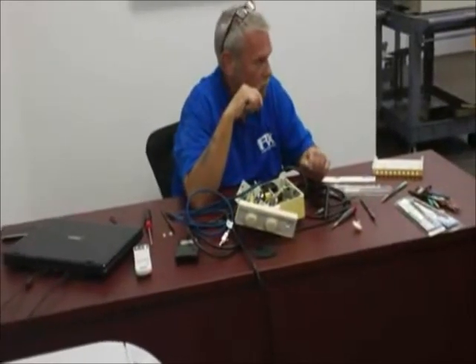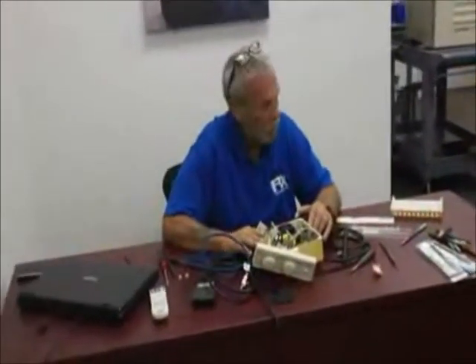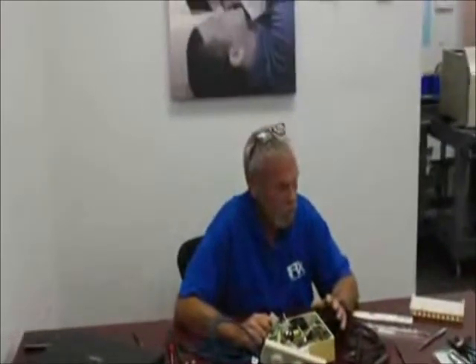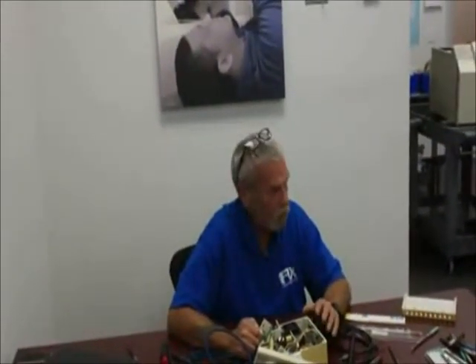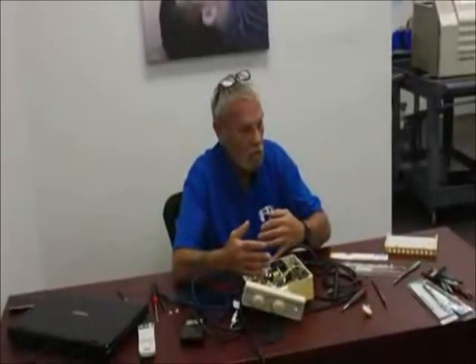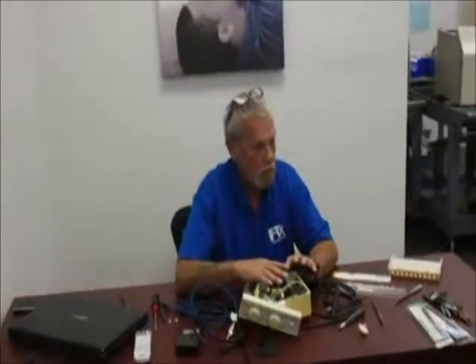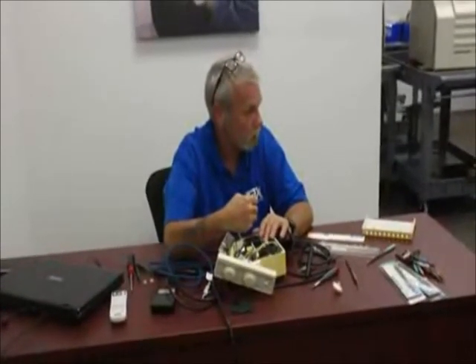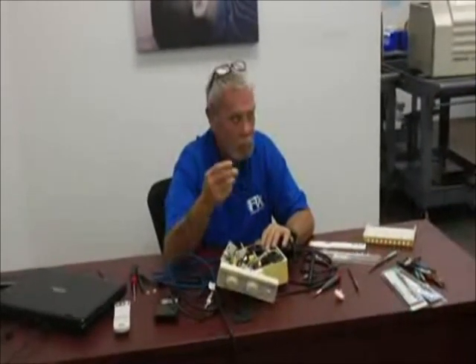Everybody uses ultrasonic scalers, so everybody has a window of opportunity here to increase revenues and make yourself more important to the doctor and his staff. It's very easy, very professional, very clean work. In closing: if we have a printed circuit board problem, please send the whole machine to SER — not just the board. We need the whole machine so we can confirm the bad board diagnosis. Thank you very much, and happy selling and happy repairing. Any questions can be fielded to Paul or myself.